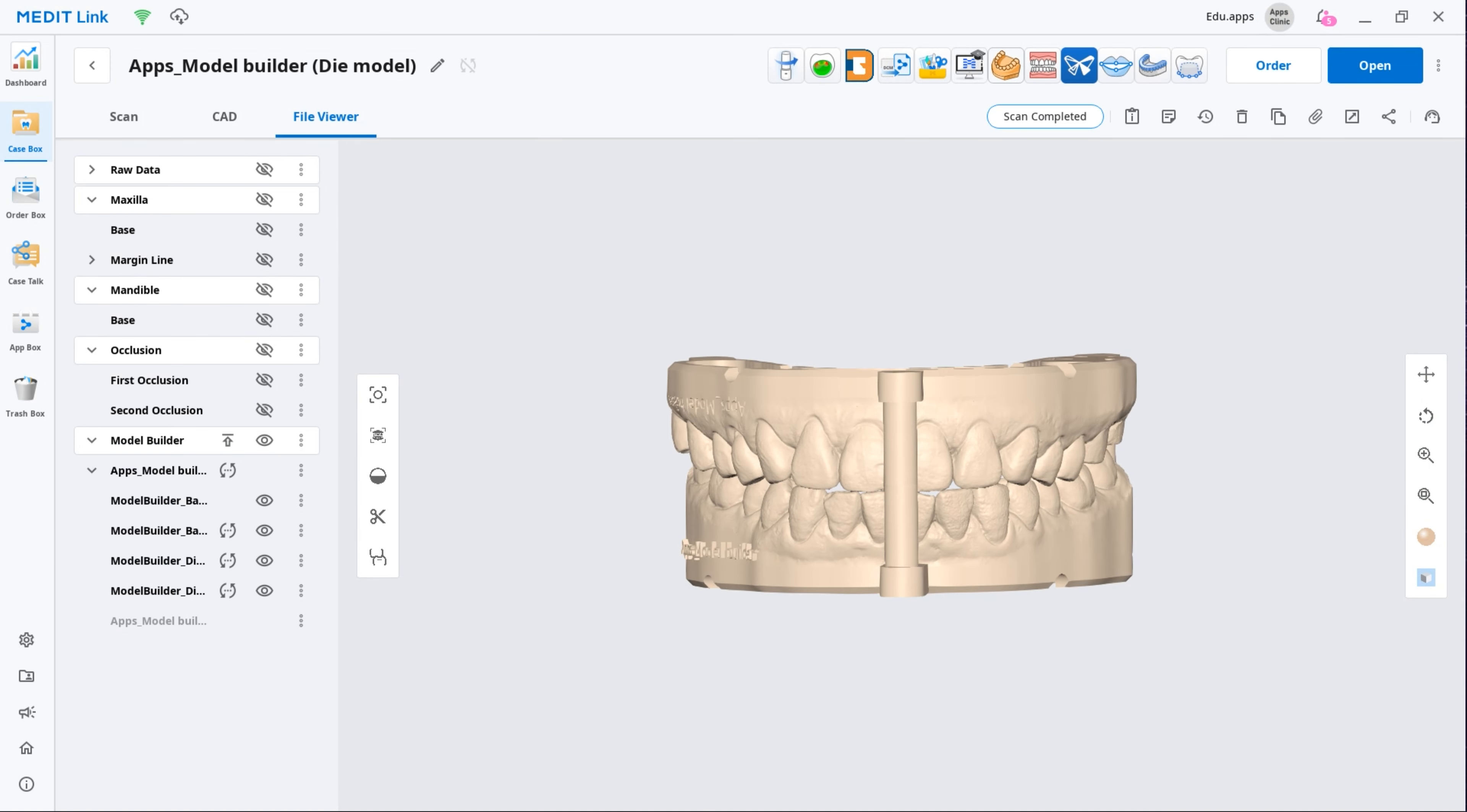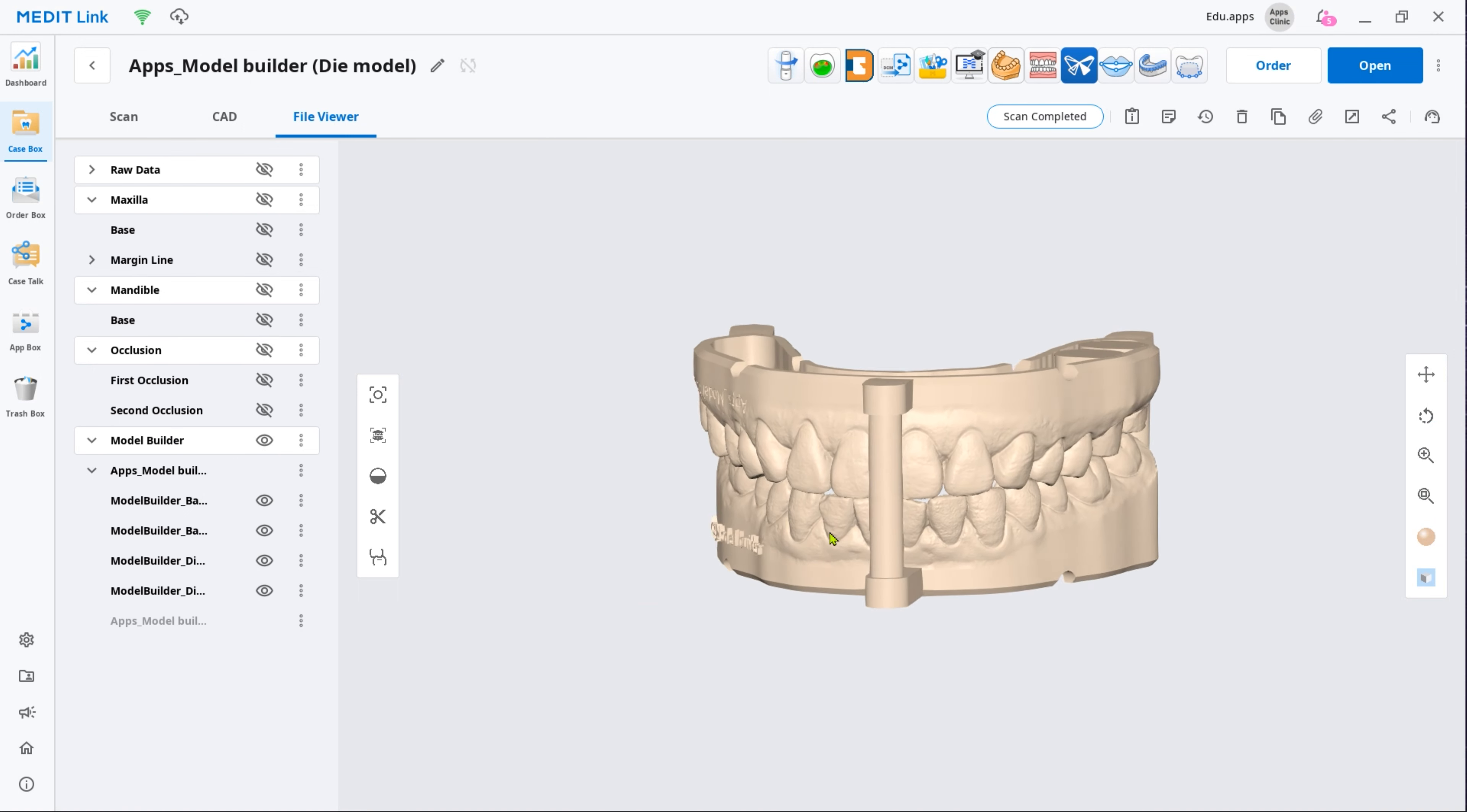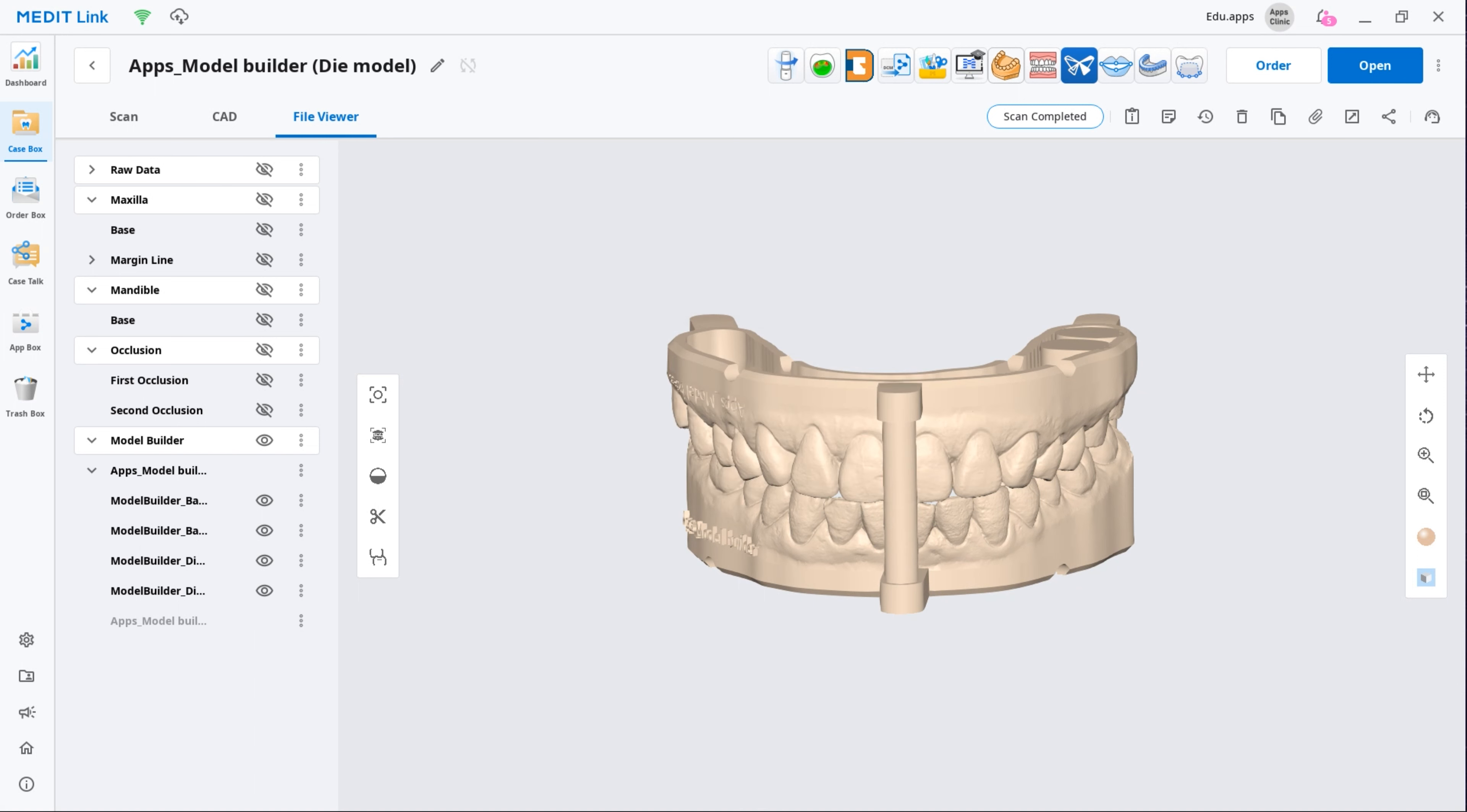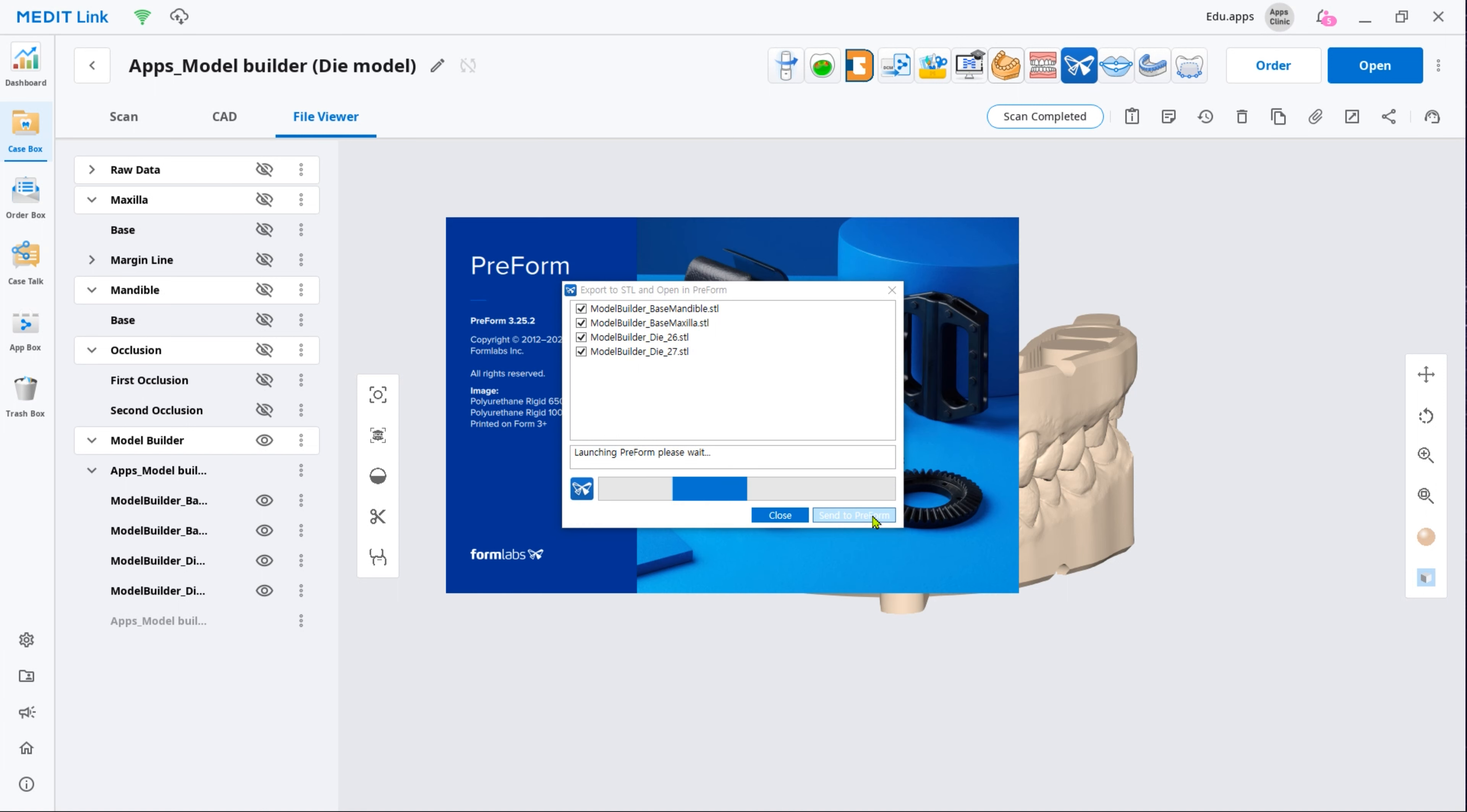Now you have a 3D printable model. If your 3D printer manufacturer has an integration with Medit, you can find their app in our app box. Install it to export the completed project file directly from Medit Link to the CAM software.